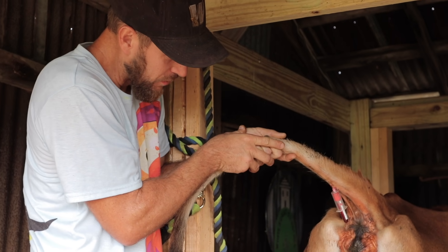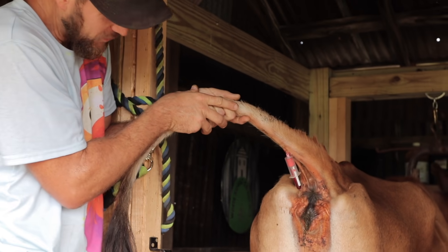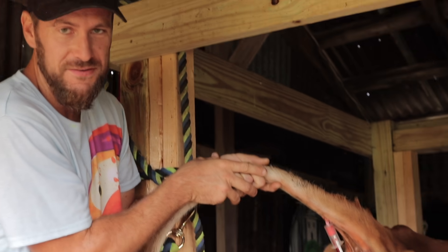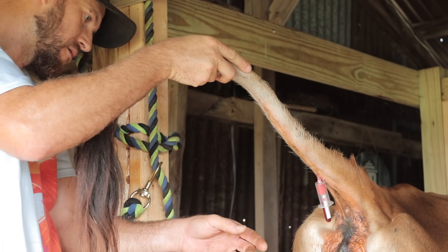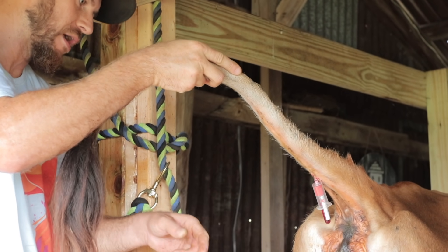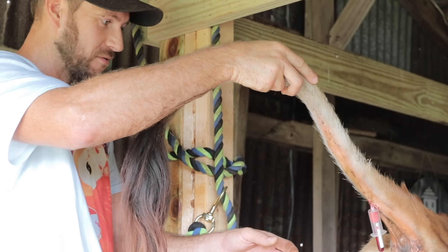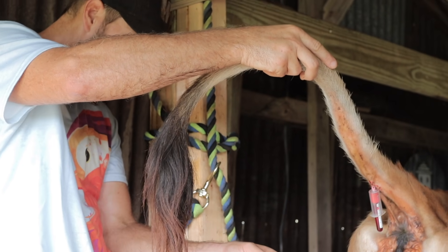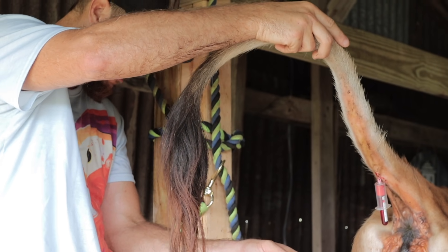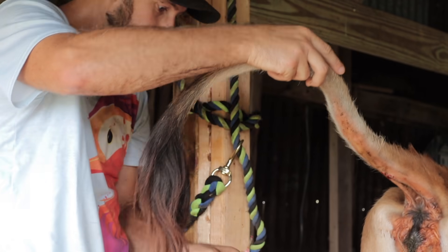As long as she doesn't move. Drip, drip, drip. It's just getting a couple of little drips, but it's going to slowly fill up. I think it's about halfway filled. I may have enough, but I think I need a little more - it's super close. I just need a drip a couple more times, because I don't know how much two cc's is. Oh my gosh, it's filling up - I think it's almost full.